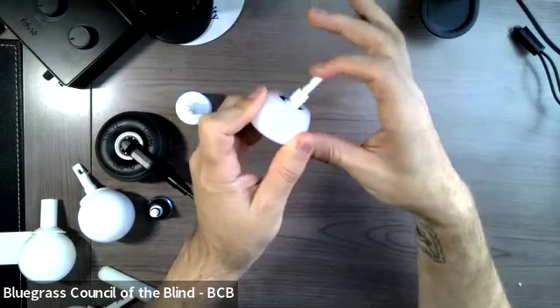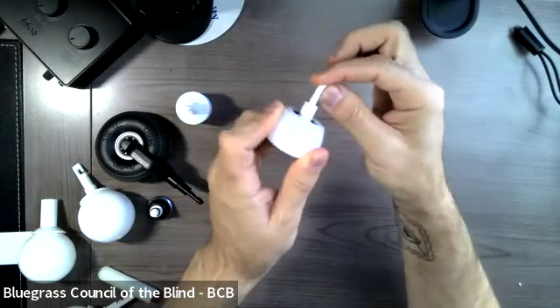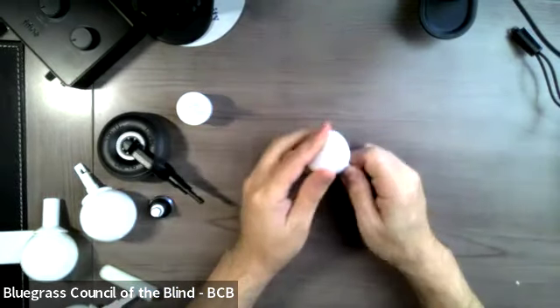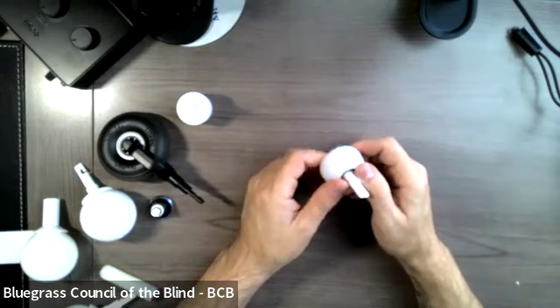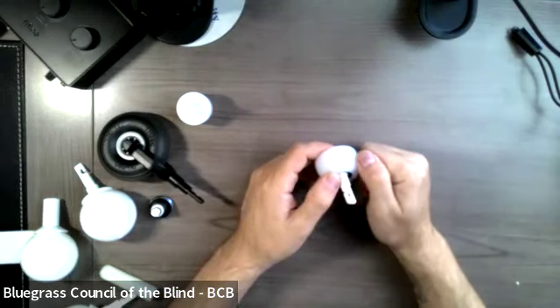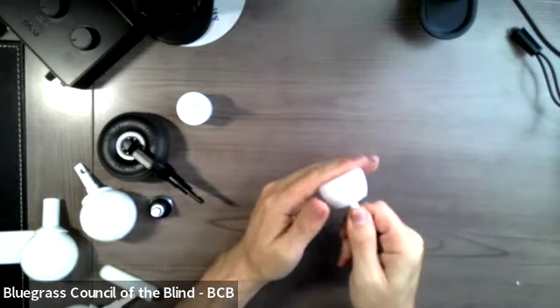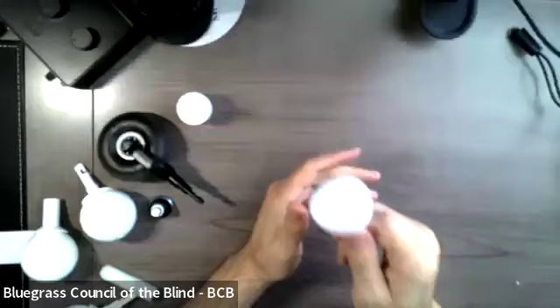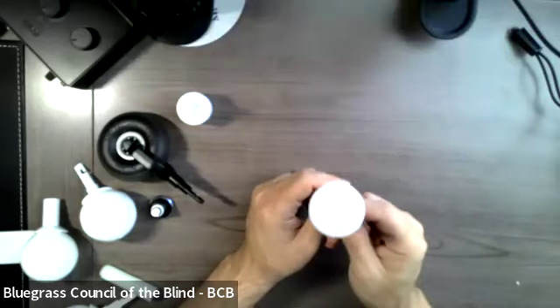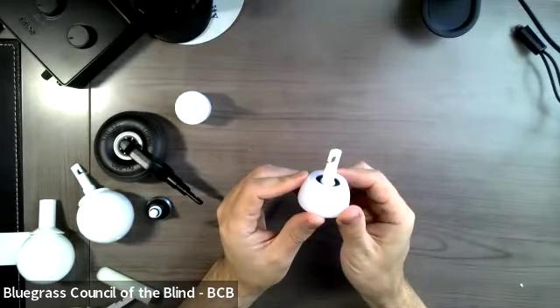So I can flex this connection, the hook connection flexes within the tip. So that helps it kind of bounce out of things. If you're walking along and you come into contact with a crack or a tree root, instead of just stopping dead and getting stuck, it might flex a little bit and bounce right out. But it's still nice and large and will avoid a lot of those smaller cracks and things.